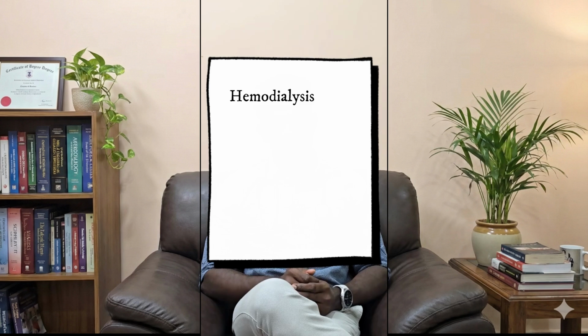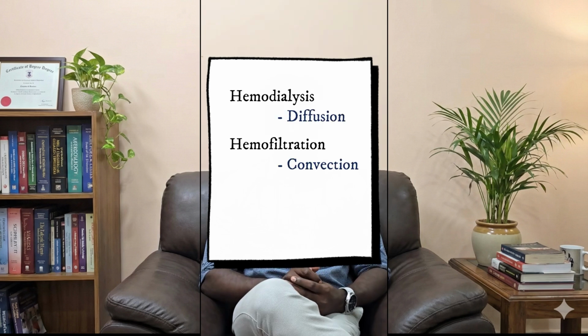When we talk about dialysis, there are actually three extracorporeal therapies. One is hemodialysis, which is based on diffusion. Second, hemofiltration, which is convection based. And the third one is hemoperfusion, which is based on adsorption. So let's see how they differ.